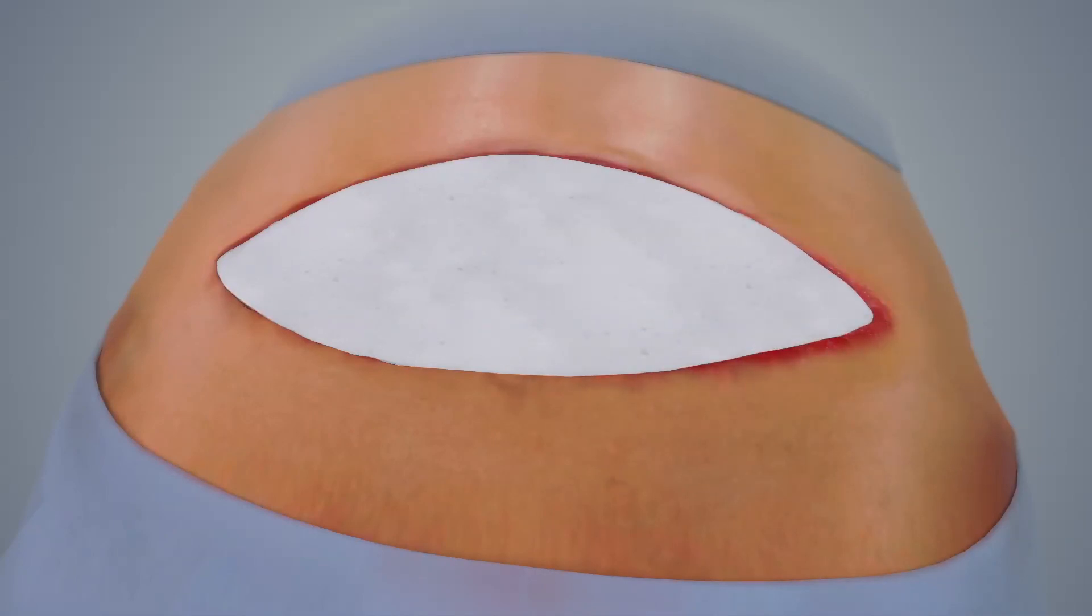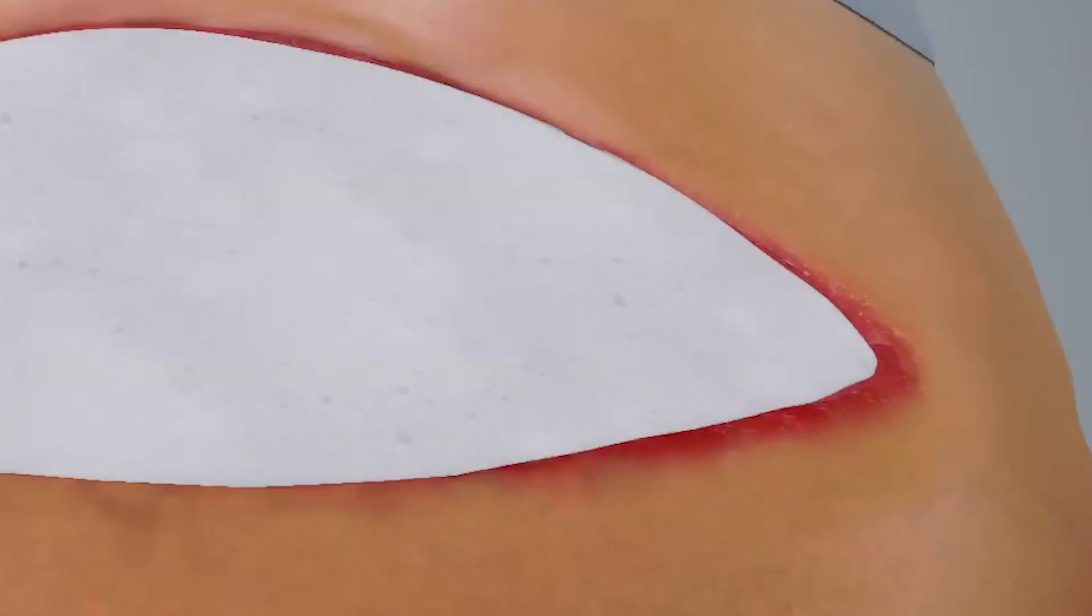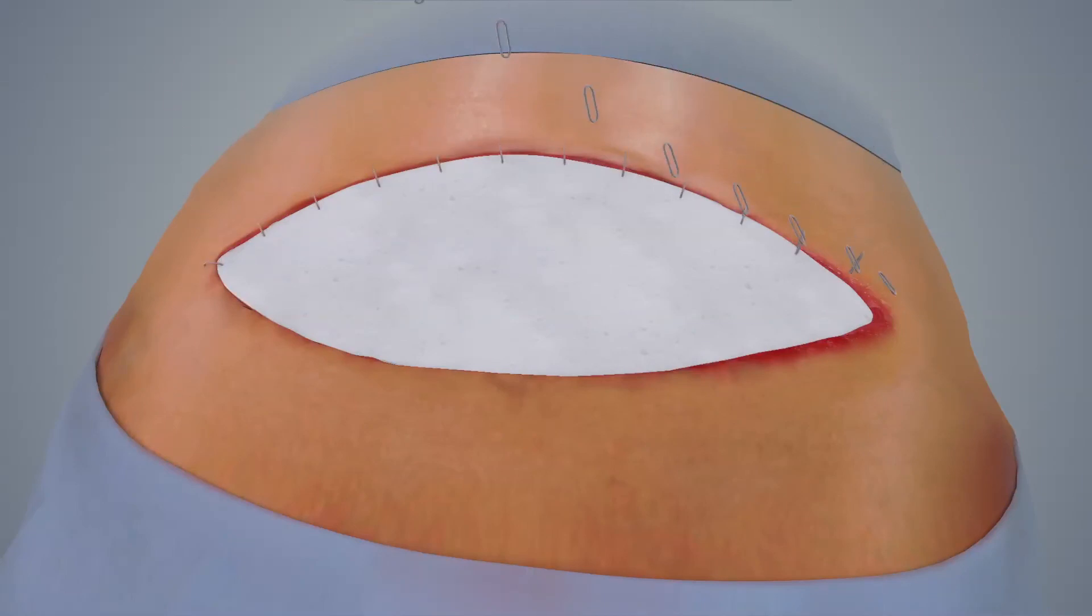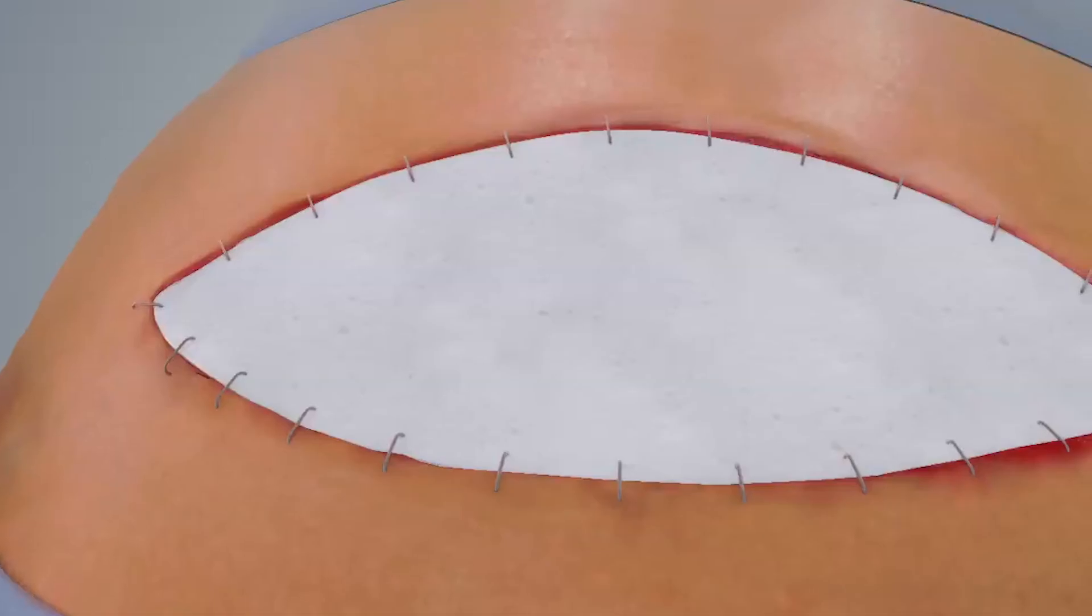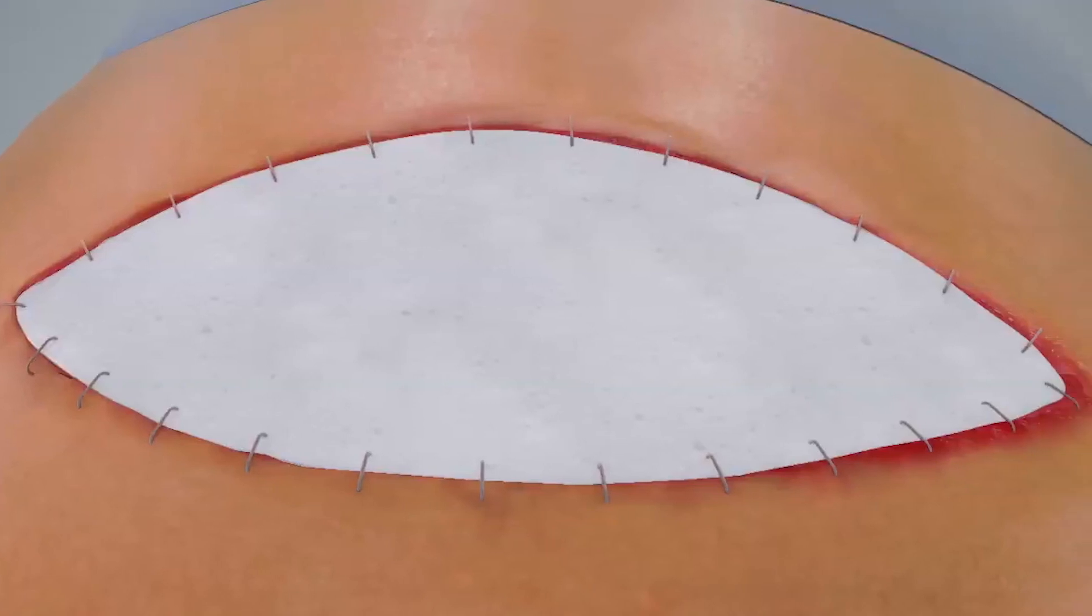BTM should be lightly tensioned to ensure apposition to the wound bed, and mattress staples may be inserted over wider areas. Staples are applied at regular intervals to secure in place.